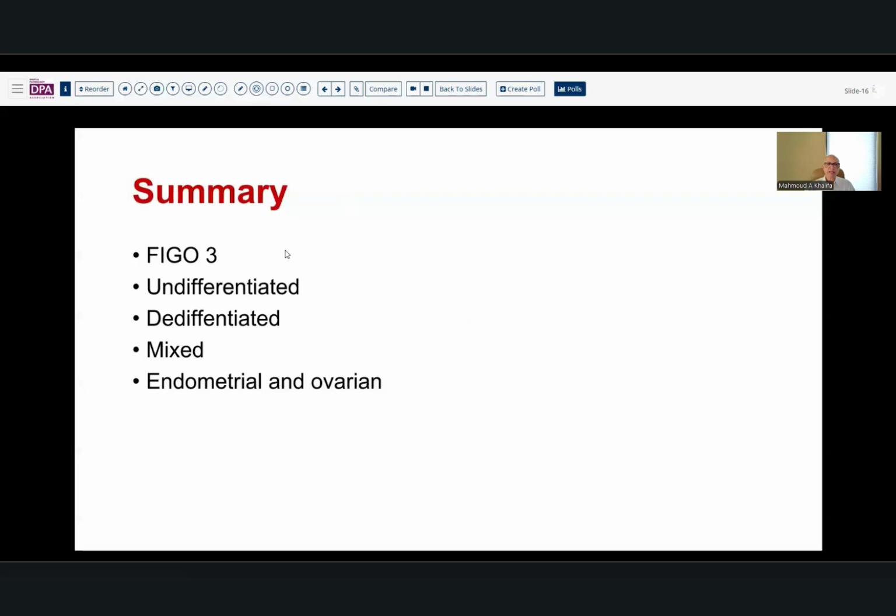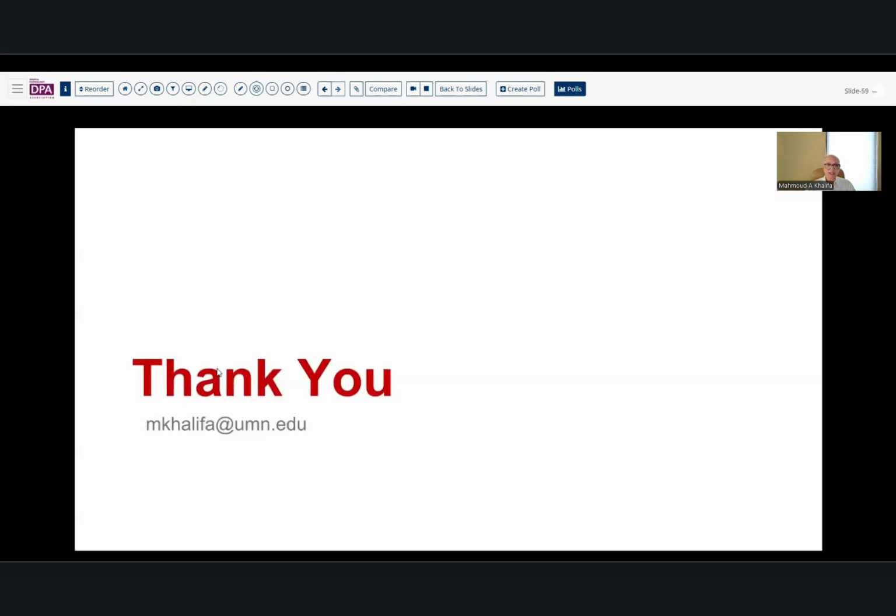So what we did today is we went over some unusual forms: FIGO grade 3, undifferentiated cancer, dedifferentiated cancer, mixed cancer, and endometrial cancer with an ovarian tumor that was unrelated to the endometrial cancer. I thank you. And if you are interested in this topic, I recommend that you review this talk multiple times because of the very subtle features of each tumor that will probably need more than one review.